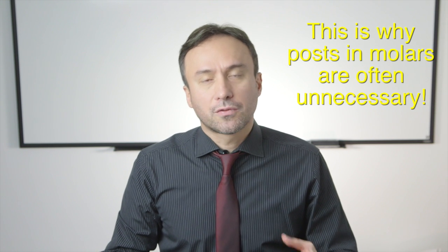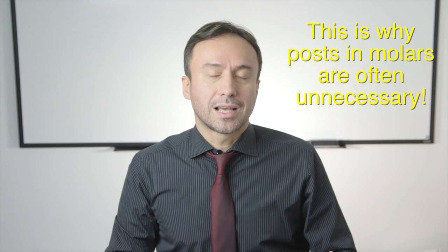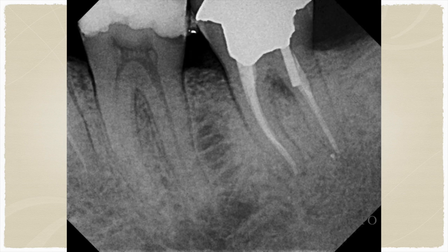Options of extraction versus surgical or non-surgical repair were discussed with the patient. Luckily, the lesion was not showing recession and a deep probing into the furcal area was not noted. As a result, the patient elected to proceed with the recommended treatment of non-surgical repair of this perforation. Perforation repair in such cases constitutes removal of the post through the crown, then decontamination of the perforation site and sealing of the area with a bioceramic cement such as the RRM Putty Fast Set. A special technique by Rehobaldendo for such repairs was used.